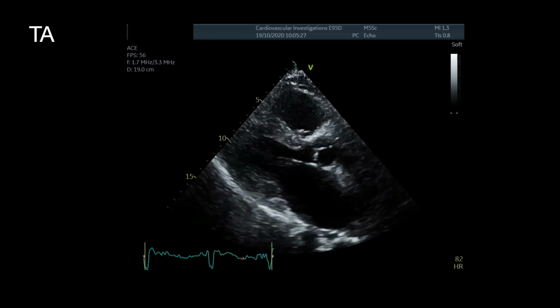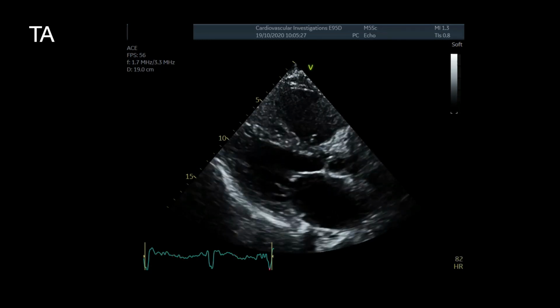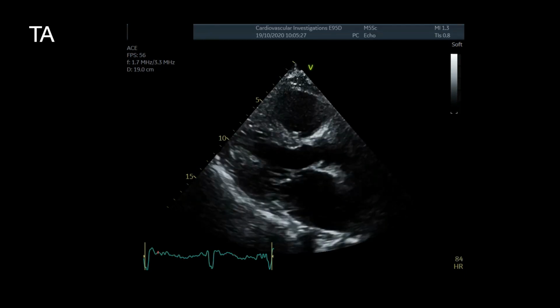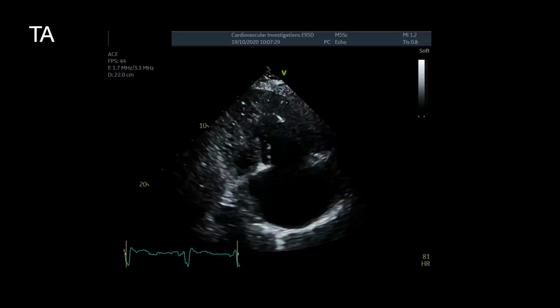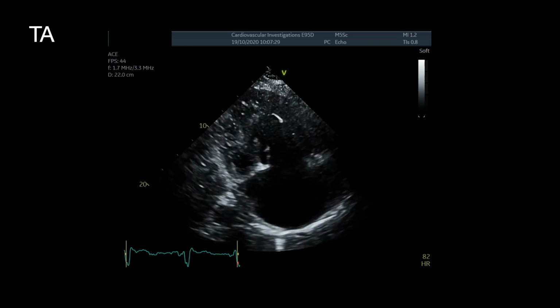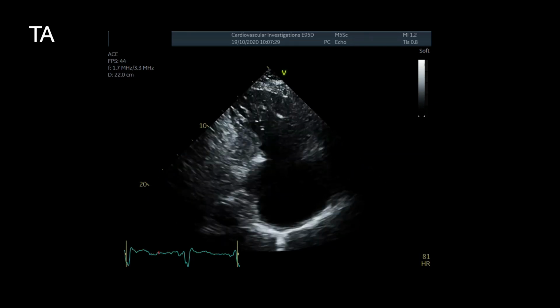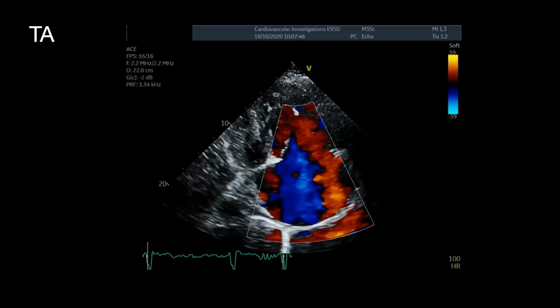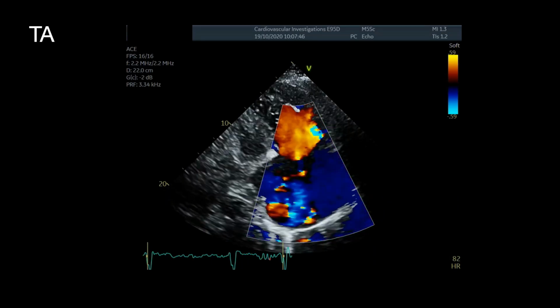And slightly different view, but same patient. It's still in the parasternal long axis. Doesn't really change our interpretation from before. This is a nice RV inflow view from the parasternal long, so achieved by tilting the beam down towards the hip. You can see the tricuspid valve in the middle there. With colour over that valve, we can see significant TR.